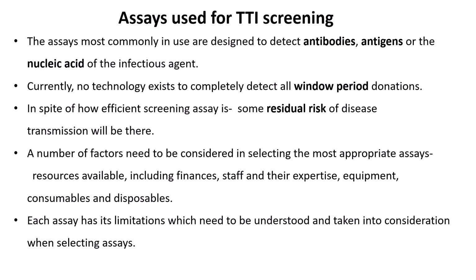There are a number of factors that need to be considered in selecting the most appropriate assay. Resources available, including the finance, staff, their expertise, equipment, consumables, and disposables. Each assay has its limitations, which need to be understood and taken into consideration when we are selecting the assay for our lab.